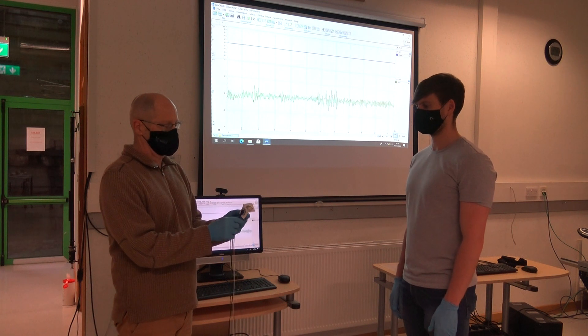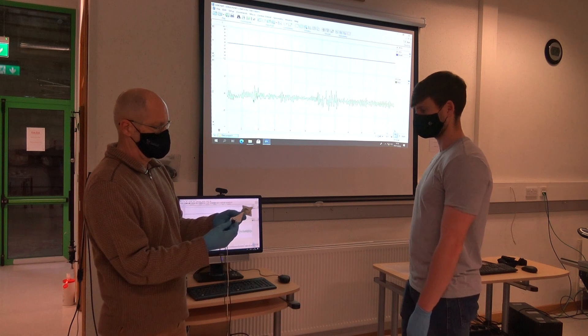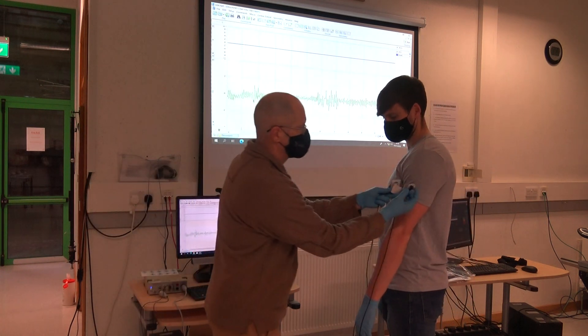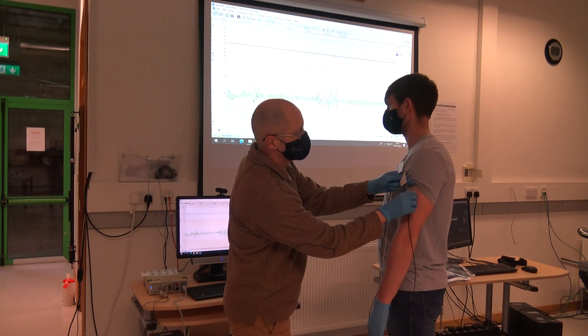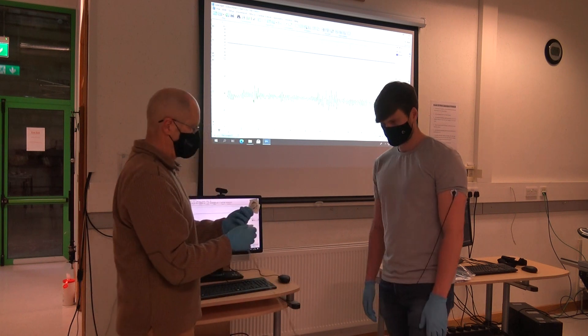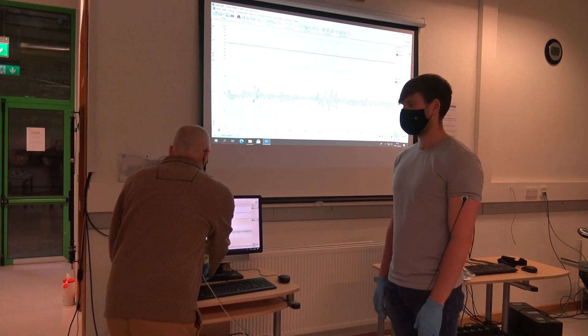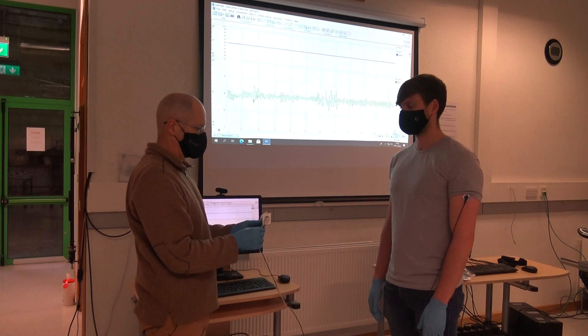Steve is going to place the first electrode on the upper part of the left arm — that's the positive black electrode on the upper part of the left arm. We don't want to place this lead and electrode on either of the major muscle groups, on the biceps or triceps, because the muscles interfere with the signal in the ECG. So it goes on the midline on the outside of the upper left arm.